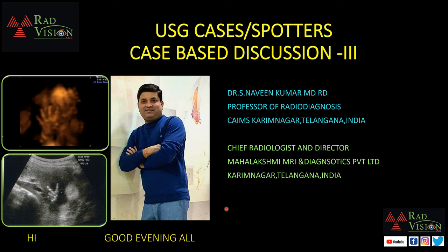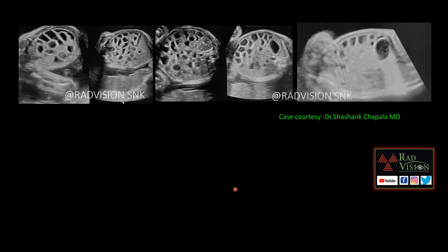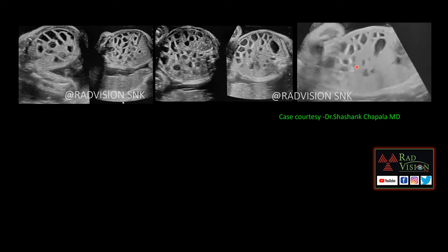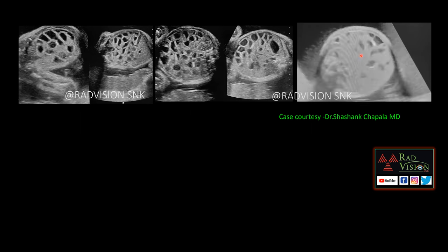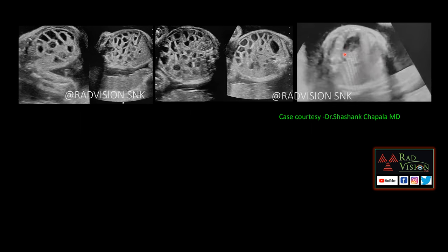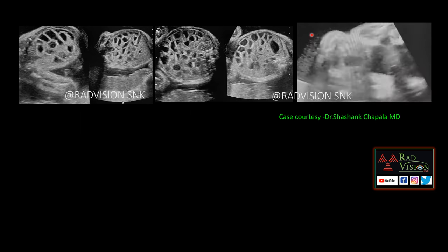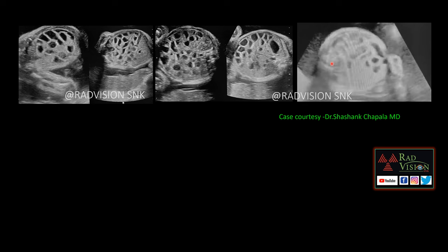New session: ultrasound cases, spotters and case-based discussion, Set 3. Here you can see a fetus where all the bowel loops — both small and large — are dilated, with associated polyhydramnios. In this video you can see both small and large bowel loops are dilated, with normal peristalsis within the bowel loops and polyhydramnios.